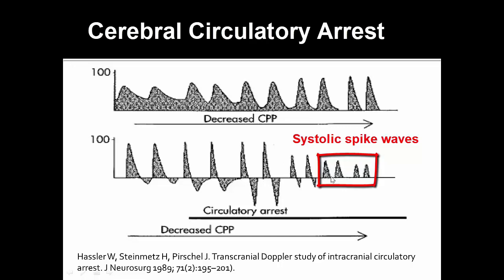This is important because when we put 50 centimeters per second into a modified Bernoulli's equation of 4v squared, the 50 centimeters becomes 0.5 meters per second. We square that and get 0.25 and multiply that by 4. The modified Bernoulli's equation of 4v squared changes a velocity into a pressure, and this pressure is equal to 1 millimeter of mercury. So therefore, small systolic spike waves of less than 50 centimeters per second and lasting less than 200 milliseconds only produce a perfusion pressure of 1 millimeter of mercury, which is not conducive with life.